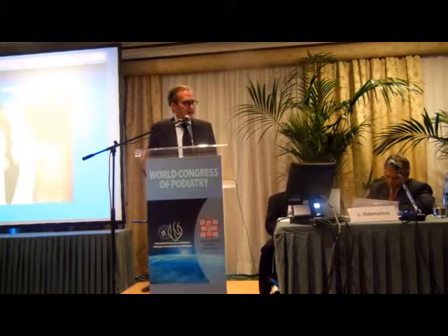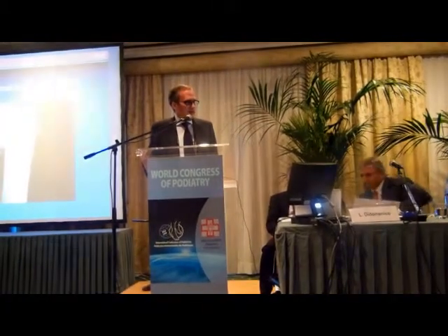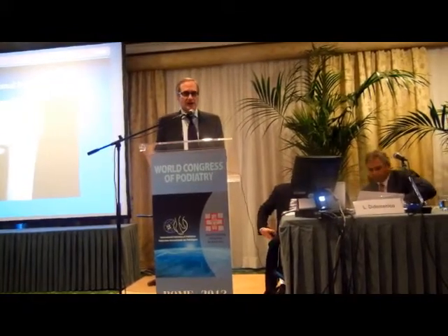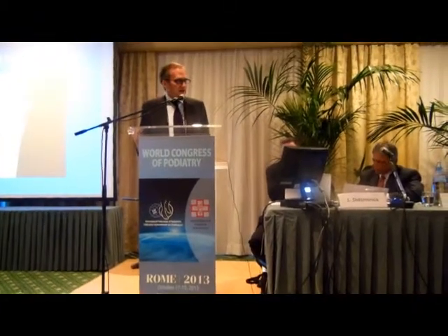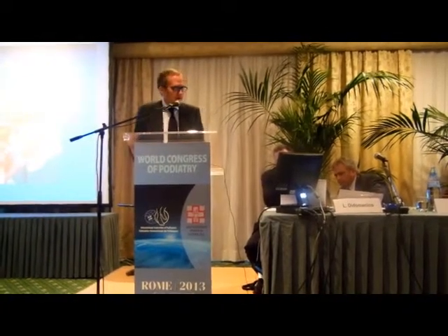Now you can fixate it or you can do it non-fixated. If you're not fixating it, then you would jam the capital fragment onto the proximal part of the osteotomy. And when you remove this, there can be a proximal ledge. If you can palpate it, you should try to remove it because the patient may feel it in their shoes. And you can do that with a short Shannon. The procedure, by the way, can be combined with an Akin osteotomy, a lateral release, and or an extensor hallucis longus lengthening. And here I'm remodeling the bump after I perform the osteotomy.